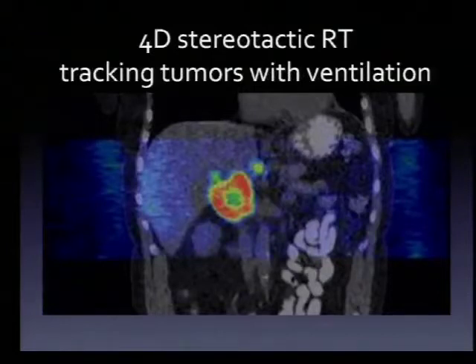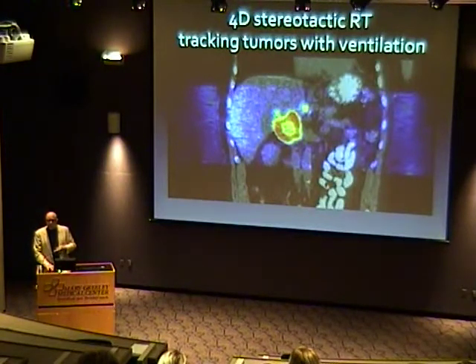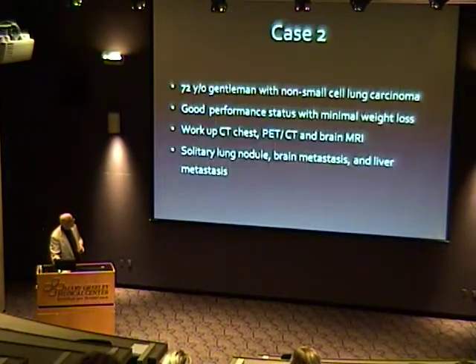And we talk about 4-dimensional radiation therapy, and that's when you're tracking a tumor as the body's breathing, for example, tracking a lower lobe lung tumor with breathing. It'll get either treated inside the ventilation cycle, or you can use a breath hold technique or abdominal compression. There's a whole number of techniques that we can use to treat lung tumors to keep that volume as small as we can and use ablative doses. But I just wanted to spend a little time with that.